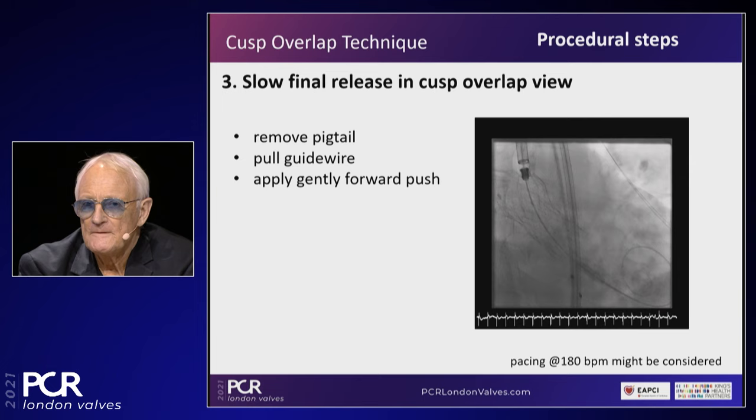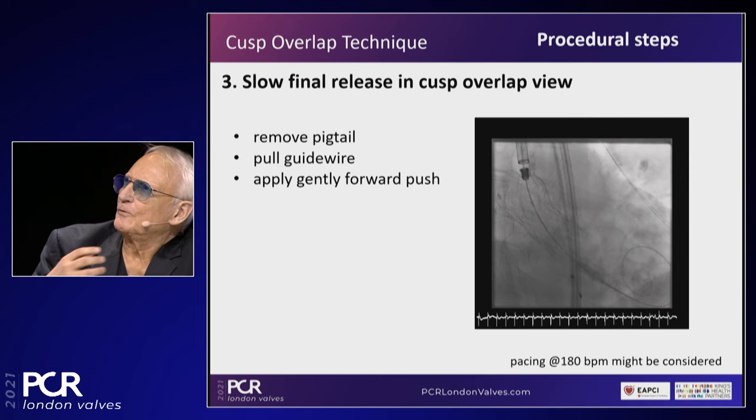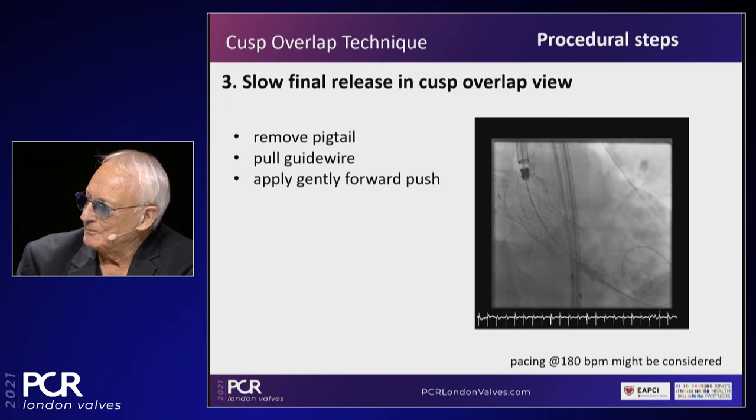Yeah, that is almost, for me, a philosophical question, because if I look back, there was initially never even a pacing issue with the release of CoreValve. Yeah. If you recall, Chaim, it came up when the 34 was launched. Exactly. Then people were a little bit more insecure, and then came this controlled pacing, and we do it to 100 or 120, not quite as high. Gentle pacing to overcome the issue.